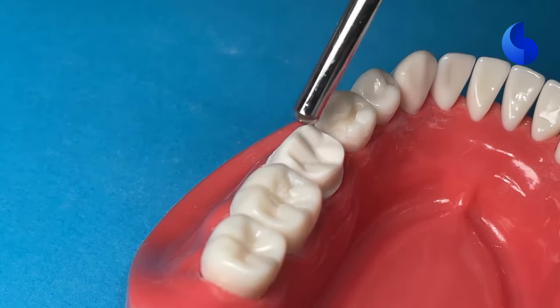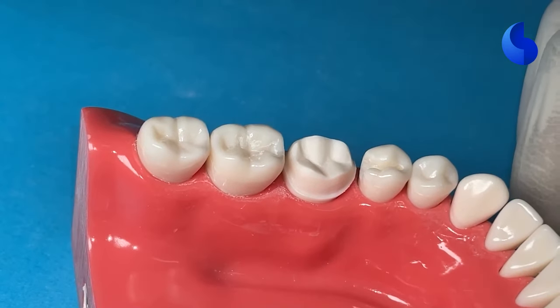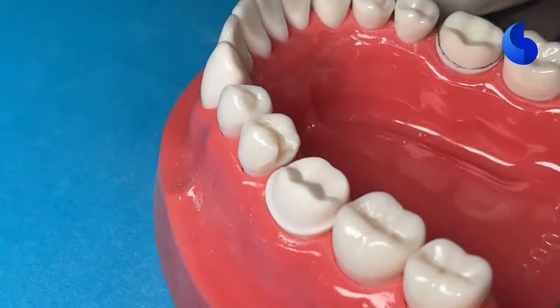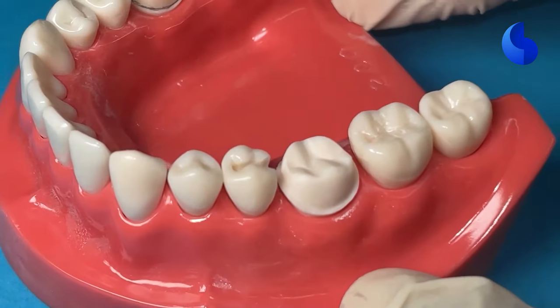And here we have our finished product. It's beautiful. It follows the occlusal anatomy. It has an even 1 millimeter margin across all surfaces. It's got a beautiful taper. And there you have it.